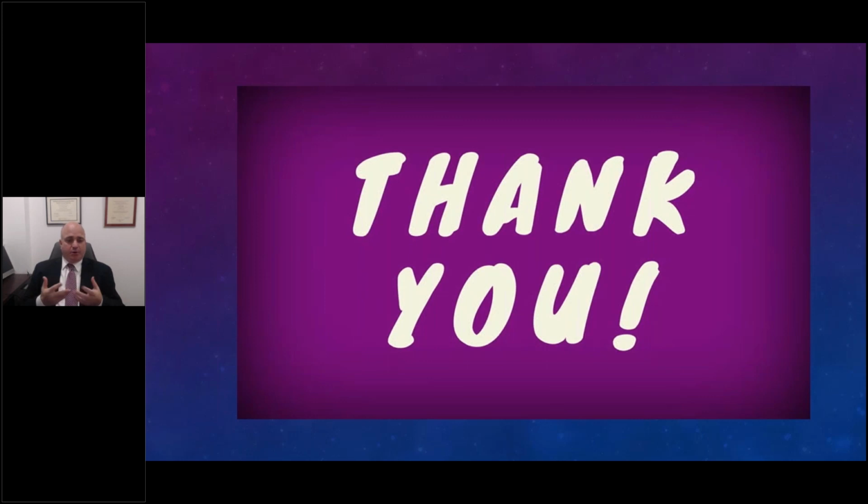So I personally do it before I did the transitions test, and I continue to do it. I don't do a lot of production, but I do it on a regular basis, once a month. If you're doing a lot of production, you may need it once a week, just to ensure that you're running the right temperature so that you get the right results every single time. I think it would be well worth your time and effort to do so.